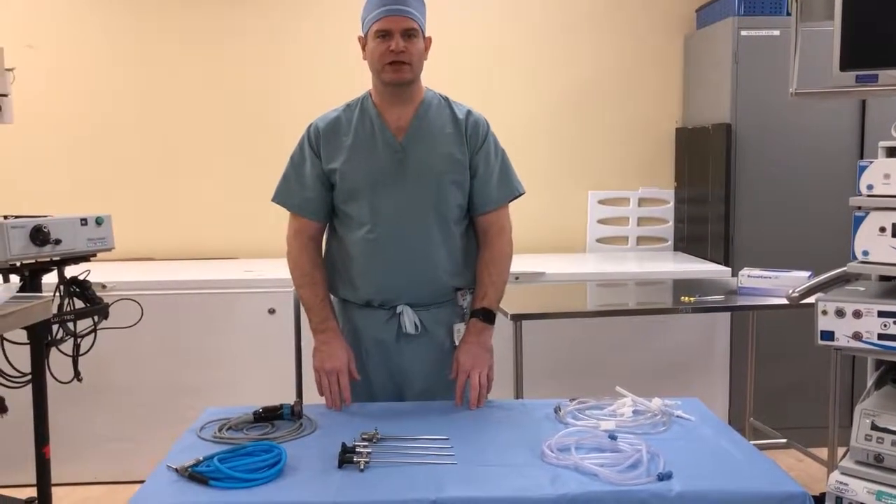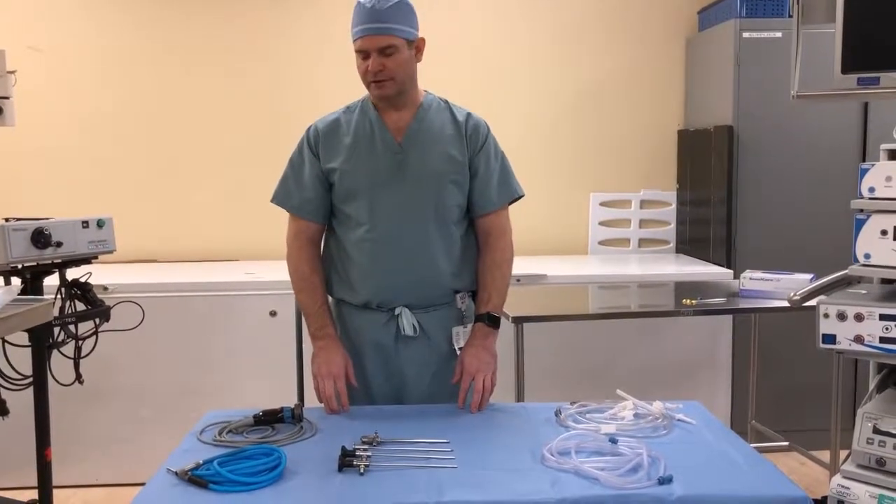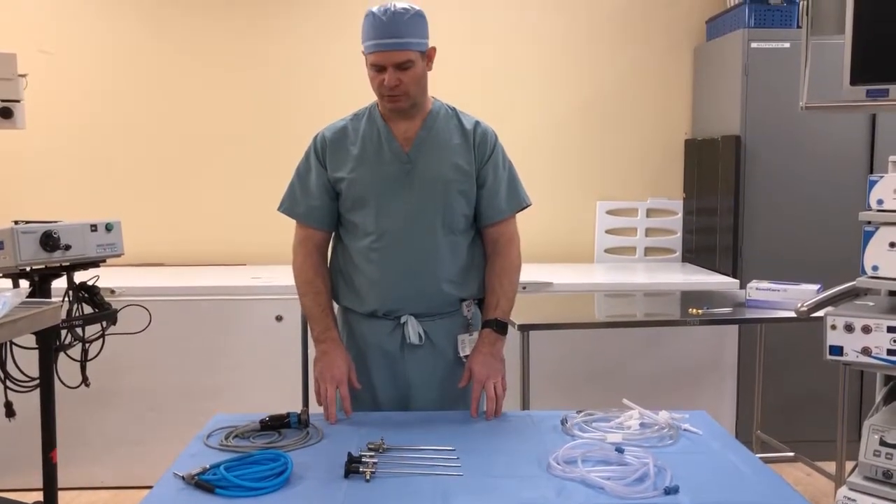I'm Greg McCandry from the University of Rochester and I'm going to be giving a demonstration on how to set up the arthroscopic video equipment.